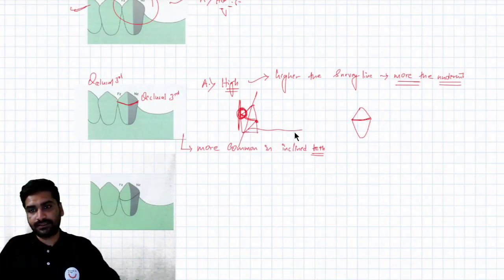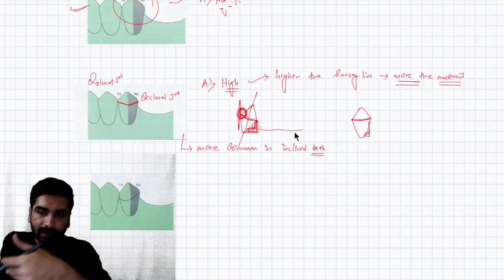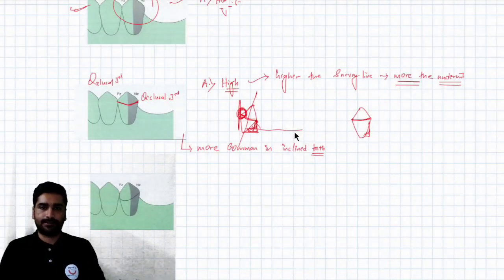See this amount of undercut and see the undercut over here. So the undercut will be more in the cases of your high survey lines. Now when you have a deep undercut, you need a type of clasp which can flex nicely and come out of that deep undercut.